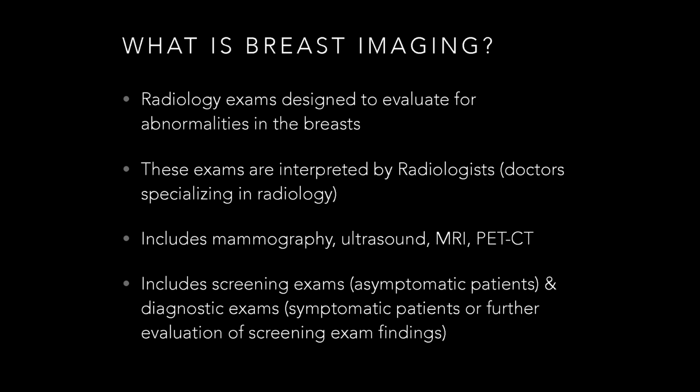This includes screening exams, which are of asymptomatic patients, and diagnostic exams, which may be symptomatic patients or asymptomatic patients who have abnormalities found on screening exam.